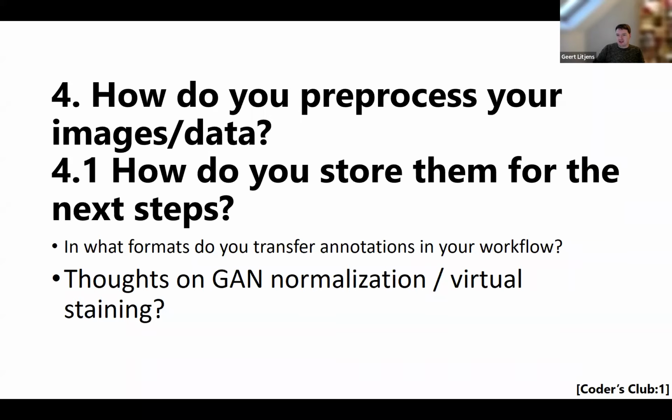I think that might actually work, but like immunohistochemical stains, I think you have to be very careful that you're not making things up, that the information is actually there in the morphology.